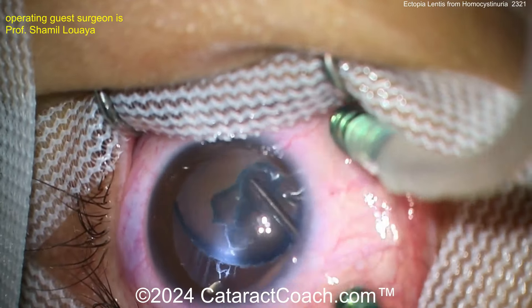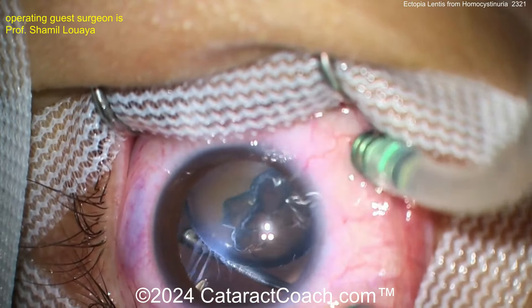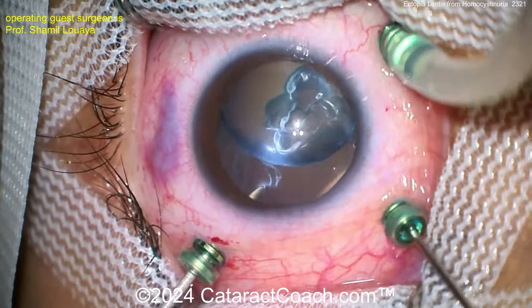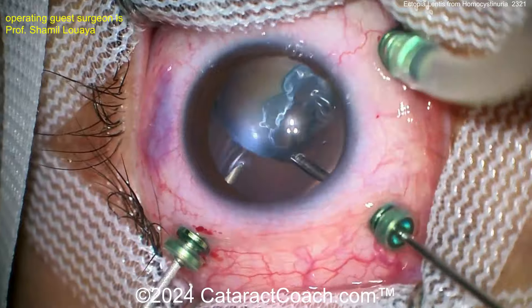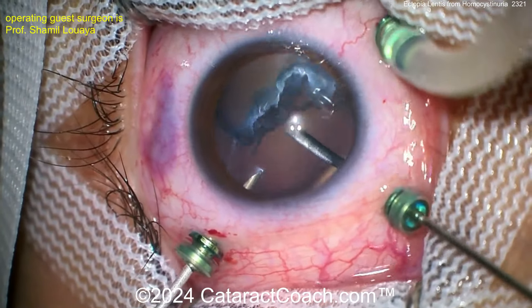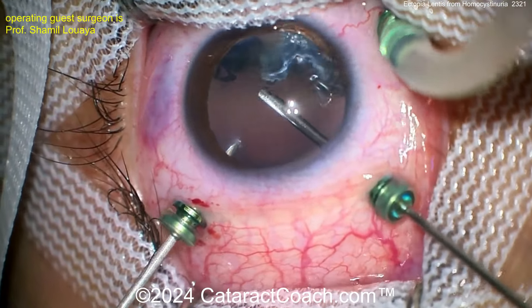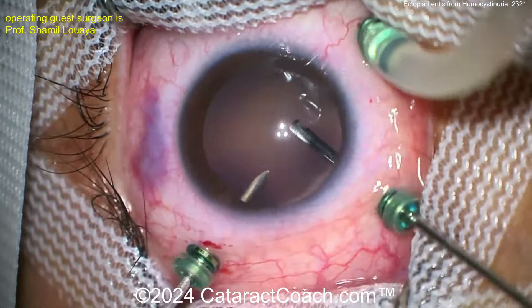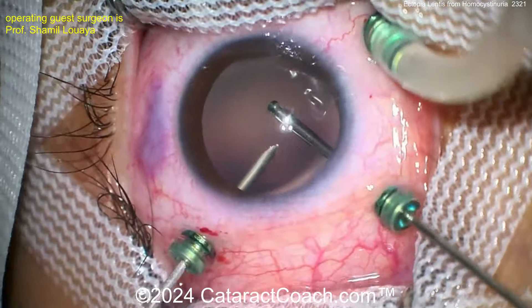Look at the zonular support here — those fibers are all weakened. The endo-illuminator really lets you see those weakened fibers. The lens here is butter-soft; it's just dislocated, not cataractous, so it's very easy to remove. A pars plana lensectomy is a great choice here.